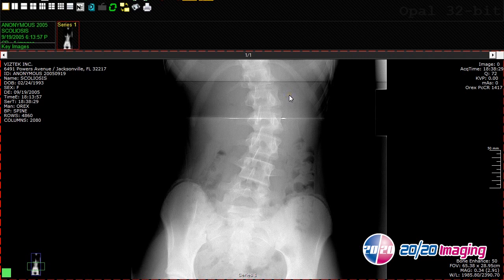Spine labels can be used to mark each vertebra in a given region of the spine, from the top to the bottom, or from the bottom to the top.